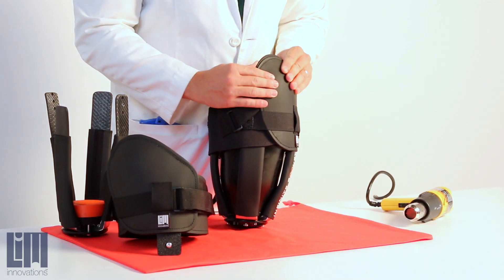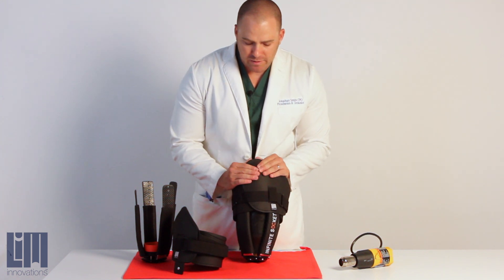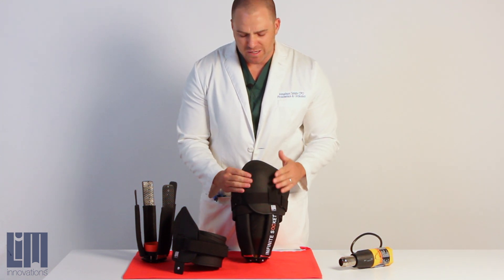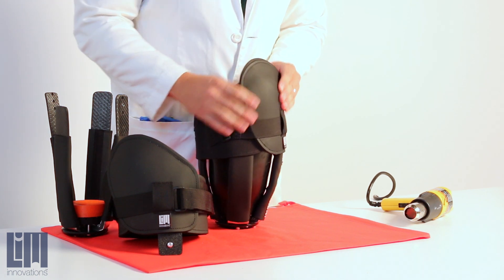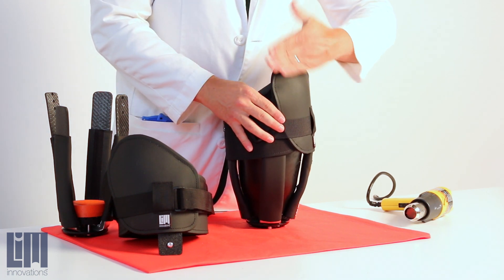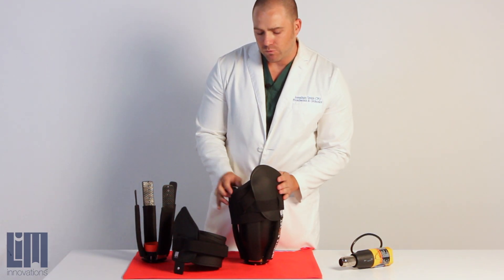It will get nice and soft and pliable, and you'll really be able to work with it easily. You'll notice it's nice and pliable and you can change the shape, kind of like a baseball mitt. You're going to want to work with it for about 30 to 60 seconds so that the changes stay inside your polyethylene. You can do that not only on the lateral paddle but also throughout your medial paddle.